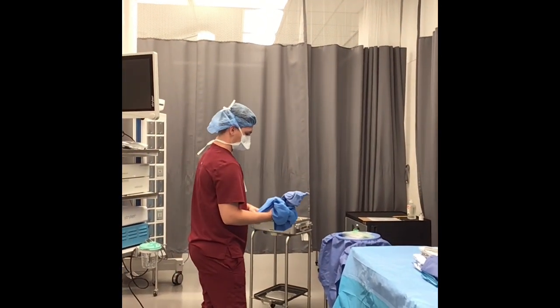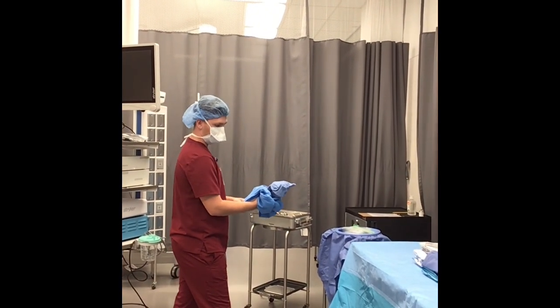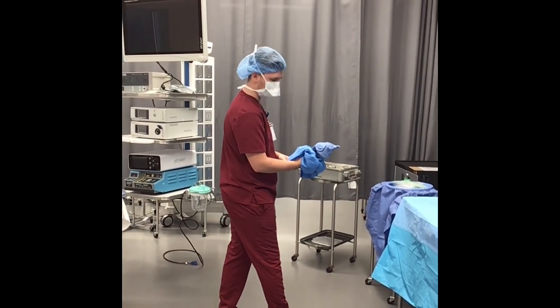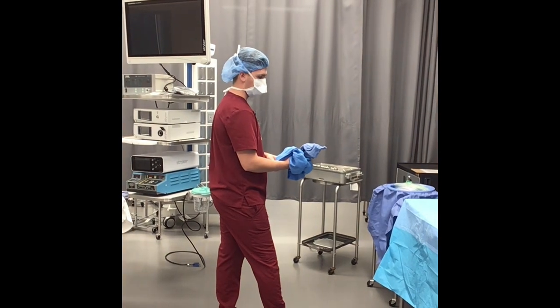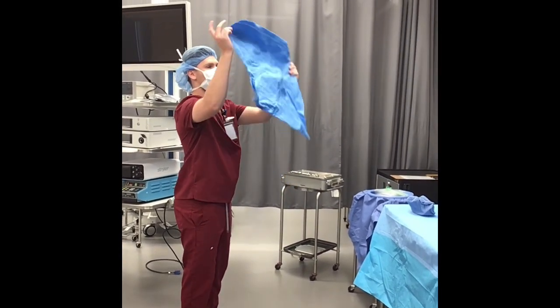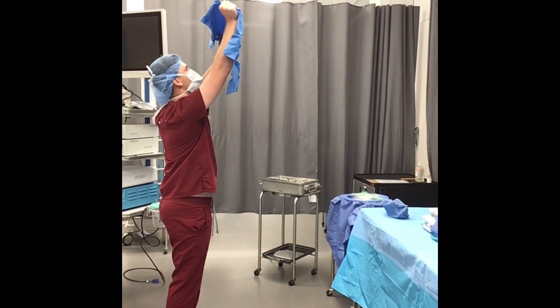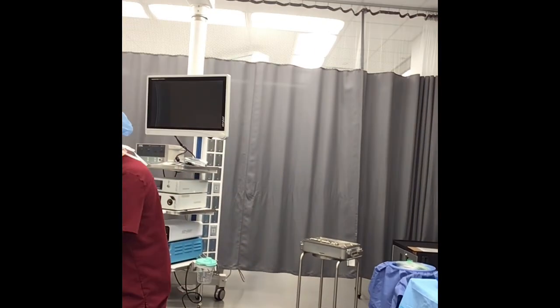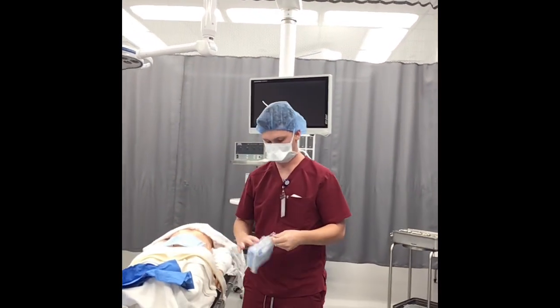So the concept for this, again, 12 to 18 inches, and I'm going to use my rocker feet. So notice how I'm staggering my feet here. I'm going to rock from my back foot forward and release. Okay? And then I'm going to go ahead and check for any holes. That is good. Okay? I'm just going to keep moving forward.